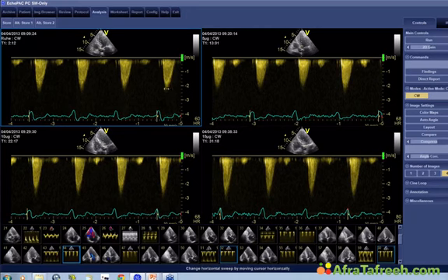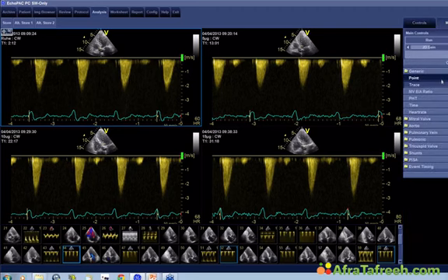We started out with a velocity of maybe 2-point-something meters, which got a bit higher, 3 meters, and at peak velocity, we came to a maximum velocity of maybe 3.3 meters. I think there was a tracing where it was a bit higher. So despite the patient having an increase in contractility, we did not get very much additional gradients.